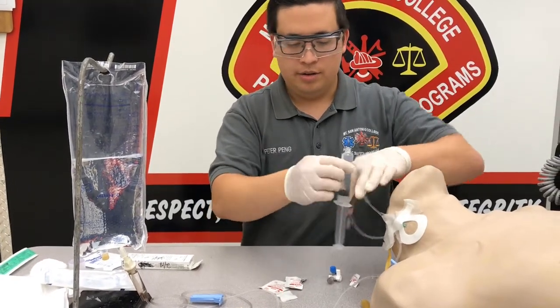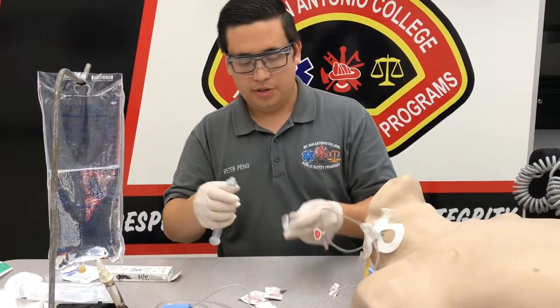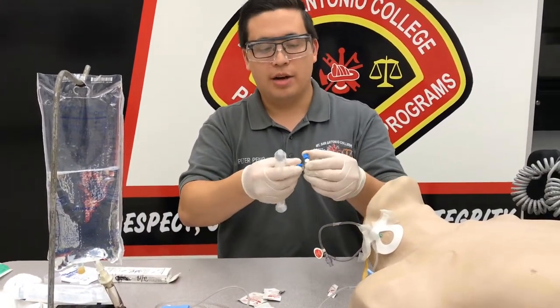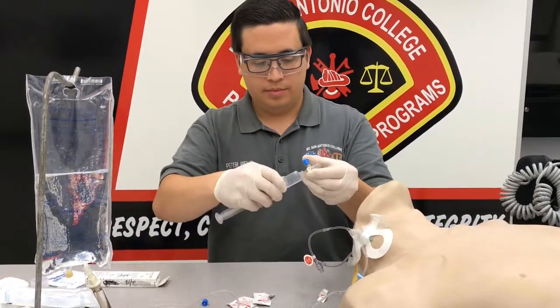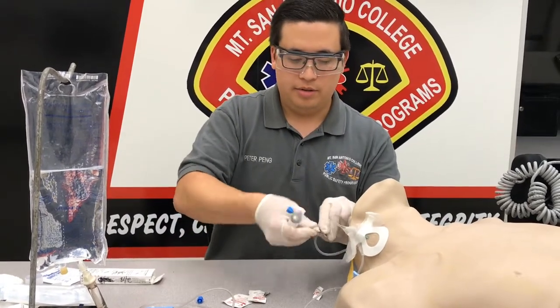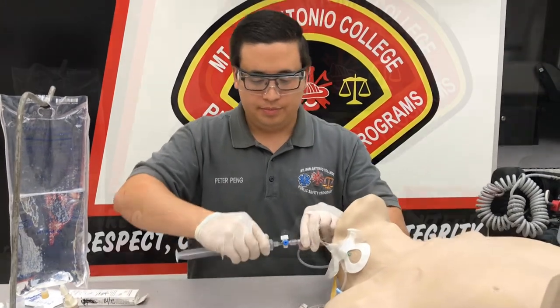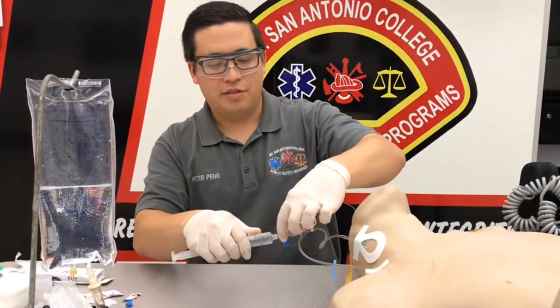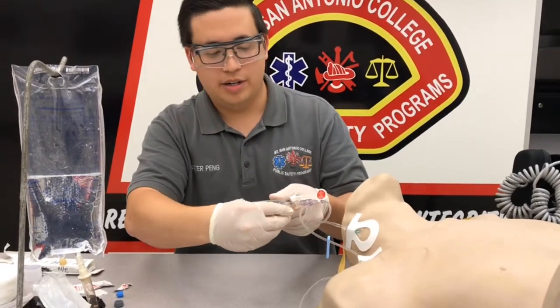Disconnect that, close off your IV line, and we're going to attach that to our three-way stopcock. We're going to clean this port and attach the stopcock onto there. We're going to turn this off to the main line, take off this cap, and attach the adenosine.